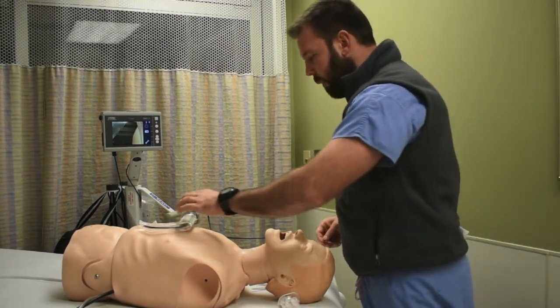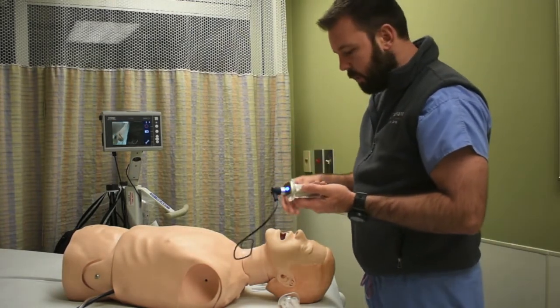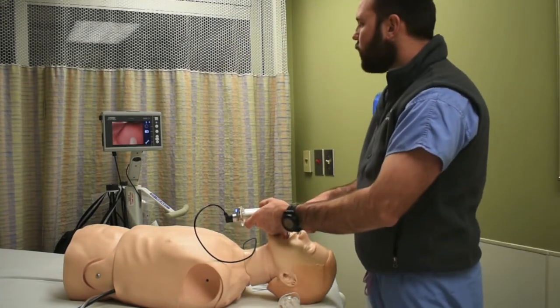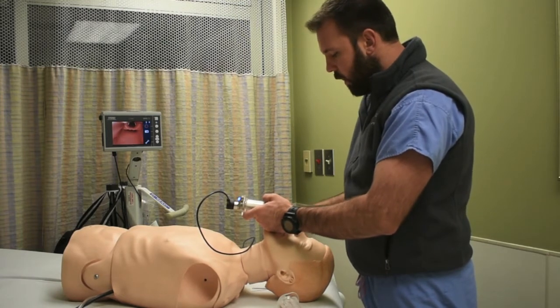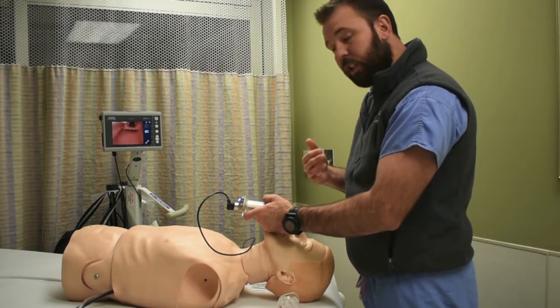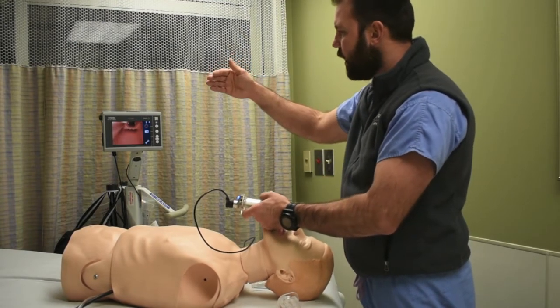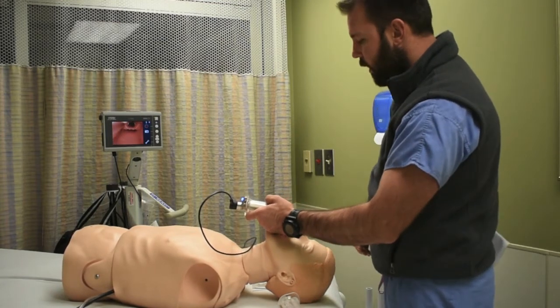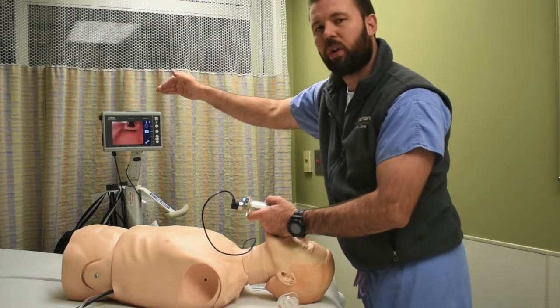Now, the steps are basically the same. We want to use those same 4 discrete steps to look into the mouth, navigate behind the tongue, look up at the screen, and get a good view. Now, the pitfalls here are getting actually too good of a view, being too close to the glottis, or having the glottis in a grade 1 view down in the middle of your screen. You actually want to have the glottic opening in the upper 1/3 of your screen.